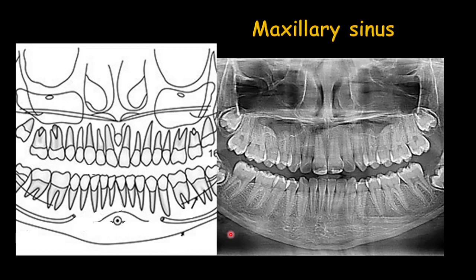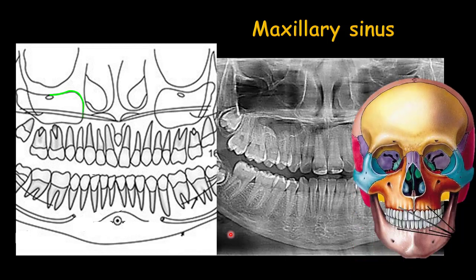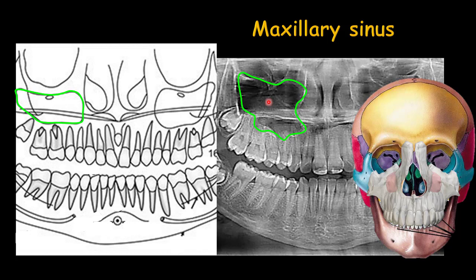The maxillary sinus can be detected as a cortical bone. You can see it in the schematic view and in this panoramic radiograph as a cortical bone. It can sometimes be pneumatized in the alveolar process. The maxillary sinus should be clear and radiolucent. This is very important because if it's radiopaque, it can sometimes indicate there is a disease starting inside the maxillary sinus.